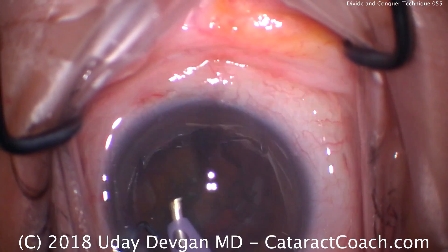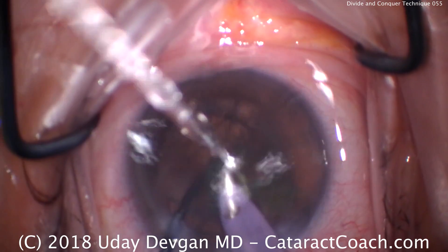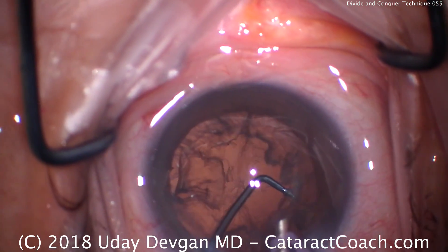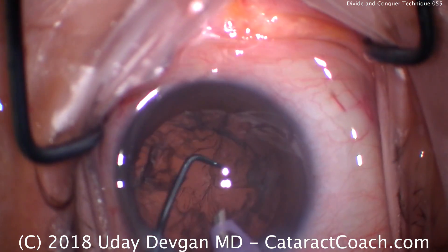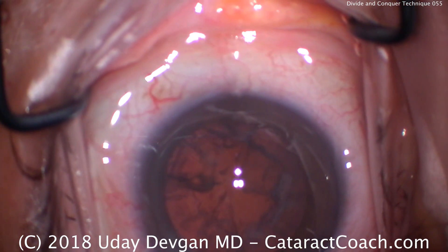Now we're left with just one quadrant in the bag. There's the last quadrant — bring it up and we will emulsify. The chopper is in the safe position to protect the posterior capsule and prevent it from coming forwards, and we've pretty much cleaned up everything here. That looks great — a little tiny piece left. Ready for our irrigation aspiration to remove the lens cortex.